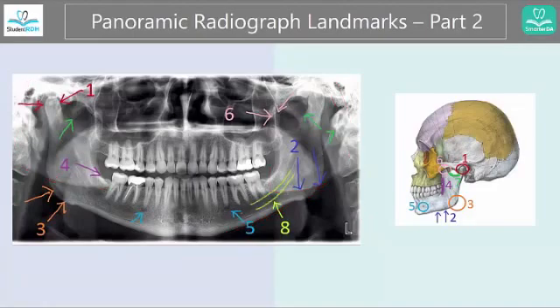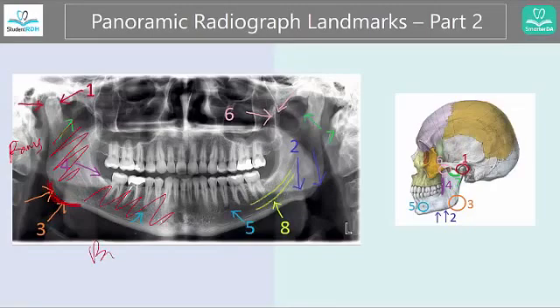Number three: this area is the angle of the mandible. The vertical part is called the ramus and the horizontal part is called the body. This part that joins them together is simply called the angle — you can see number three here.